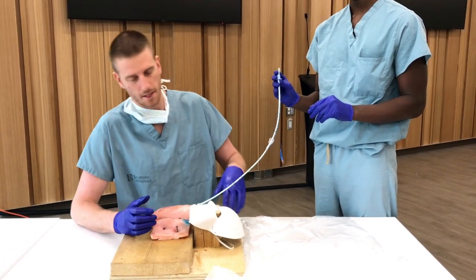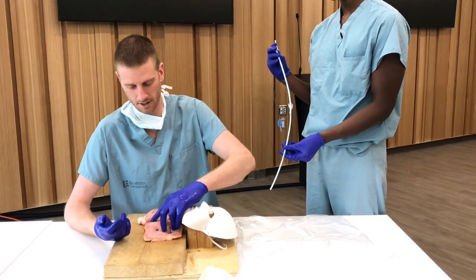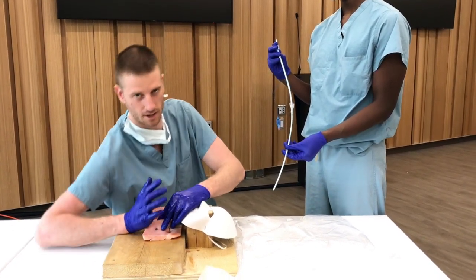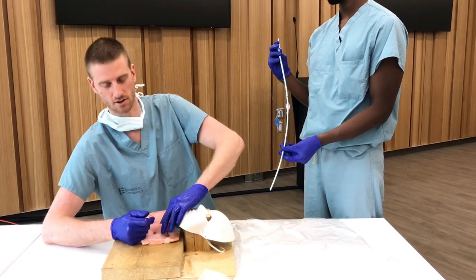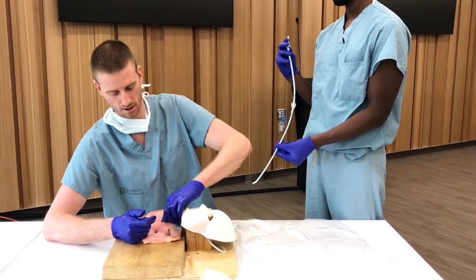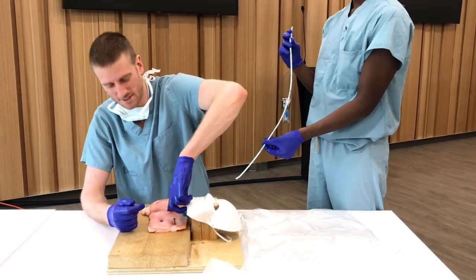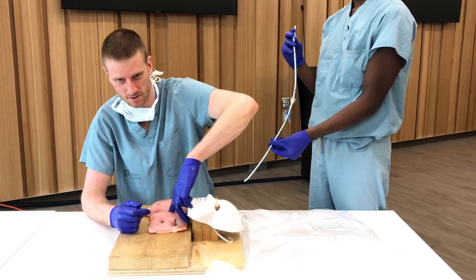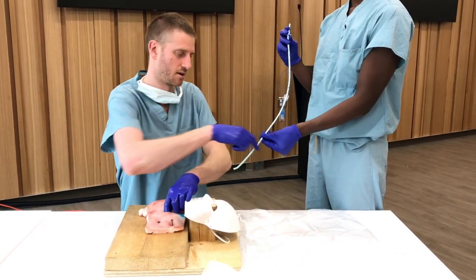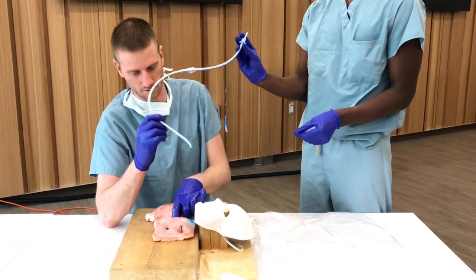Okay, so doing my 6-part motor pattern, I have stabilized the larynx, I have gotten my landmarking done, I've stabilized my forearm on the patient's sternum, I've made my cuts, my finger is into the cricothyroid membrane space, and I've dove that finger all the way to the back of the trachea, and I'm actually feeling the posterior aspect of the cricoid ring and the trachea itself, okay? And now I'm getting the bougie passed to me by Osman in the correct manner.